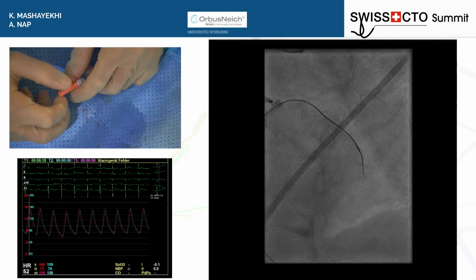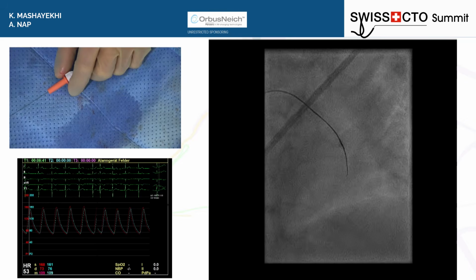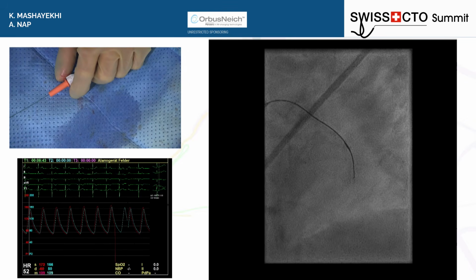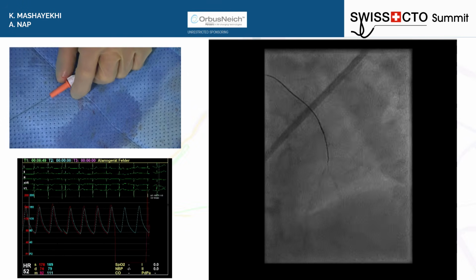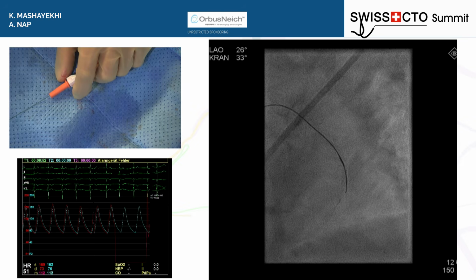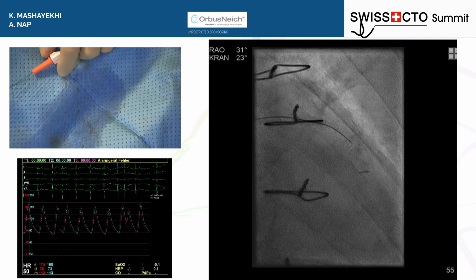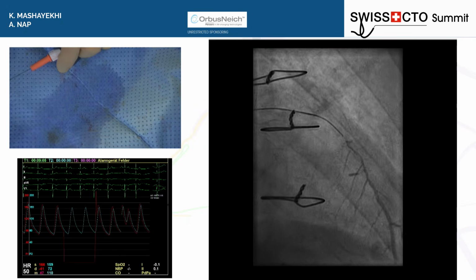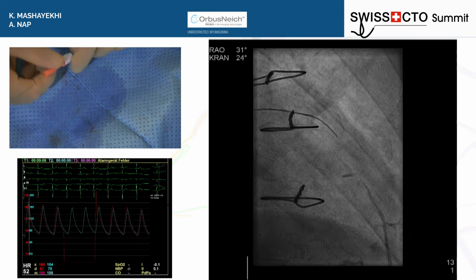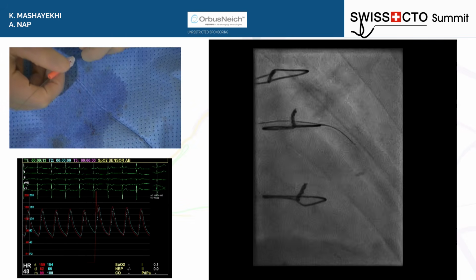We heard algorithms yesterday already about when the wire goes but the MC doesn't. Can you give me a check? Several options. You want an injection? Yeah, please. Okay. So there is somebody in the room shouting at us. Another one? Yes, please. Go. So we are not dead here. We also have some support from Sicily, screaming around.